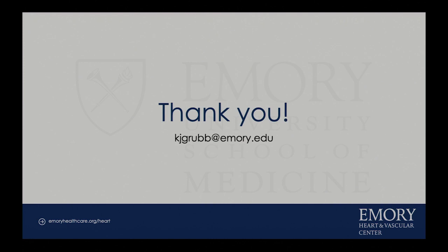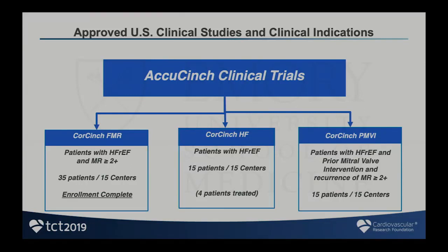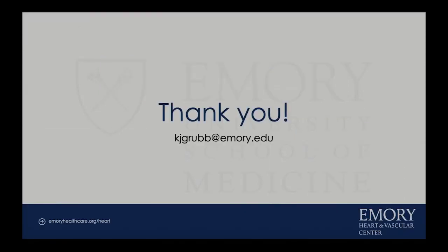So I think the COAPT data now stands as a very low bar, because all of these mitral devices appreciate that there are some limitations to it. It's not going to take much in the functional arm to have better results than MitraClip for functional mitral regurgitation if you take all comers. Do I expect that you're going to have some exclusions? I do. I took the slide out, but if I had left it in, you would see that even in the ventriculoplasty, they're not taking all comers for mitral regurgitation. You have to look at wall thickness, you have to look at scar, so you're excluding some of your ischemics that may be good candidates for MitraClip, COAPT, et cetera. So it gets very, very challenging.